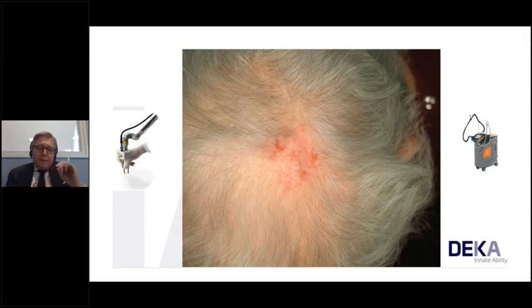We have even a sort of rejuvenation at the molecular level. So the number or the percentage of the basal cell carcinoma that we have in the skin, usually before the treatment, we don't see any recurrence after the fractional.